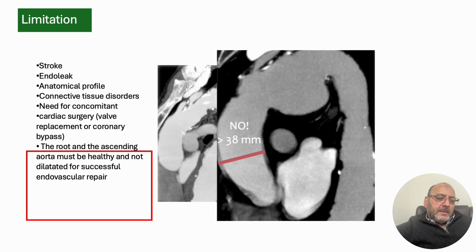For aneurysmal disease, endovascular treatment is very limited, although there are studies now looking into eligibility for patients who have ascending aortic aneurysms, with pretty good, favorable outcomes, and we'll go through that throughout this presentation.